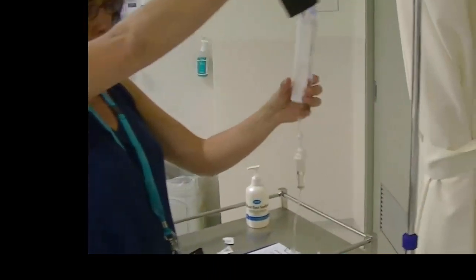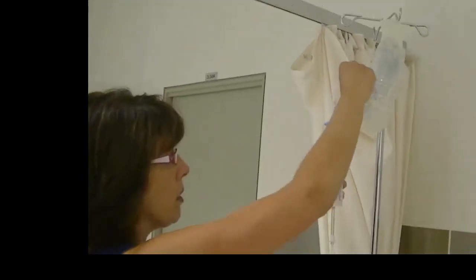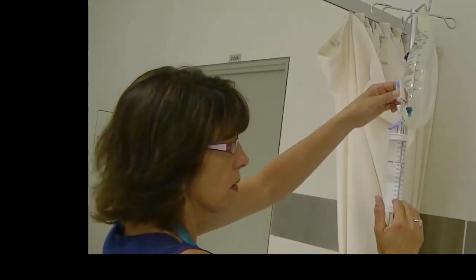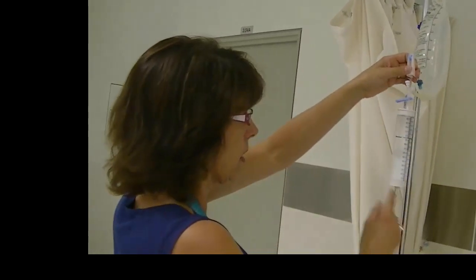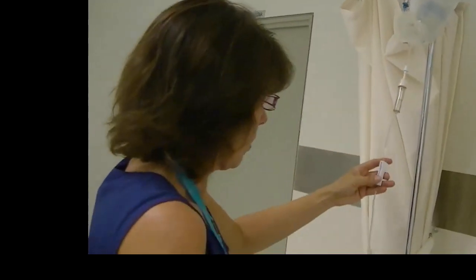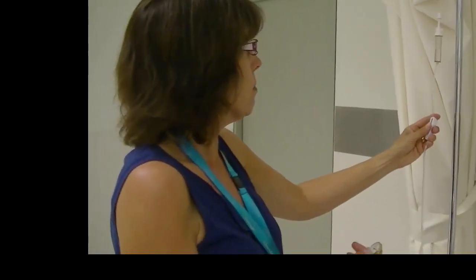I might hang your burette up a little bit higher so I get better pull of gravity. When I hang the burette up, make sure that I can read the numbers. And do not turn the burette upside down, you'll only get air down the line. So I'll put that up here like that. And here we go. I've got my watch. And again, be patient.